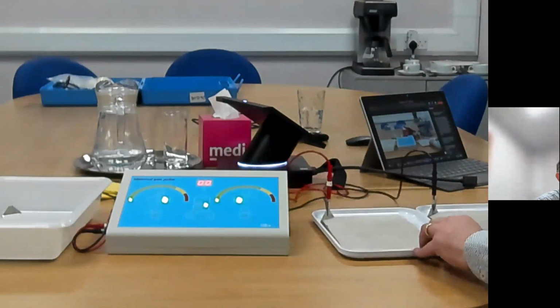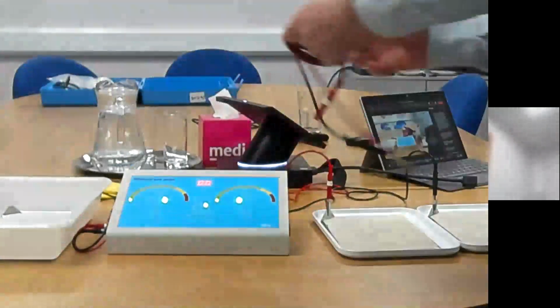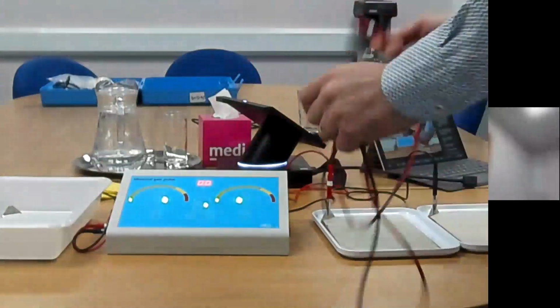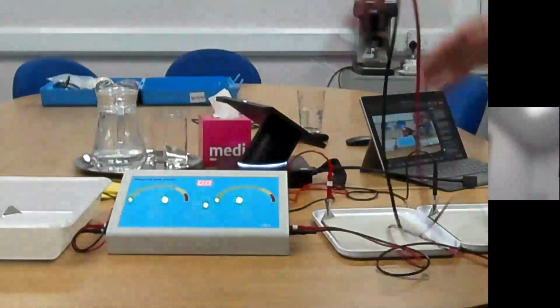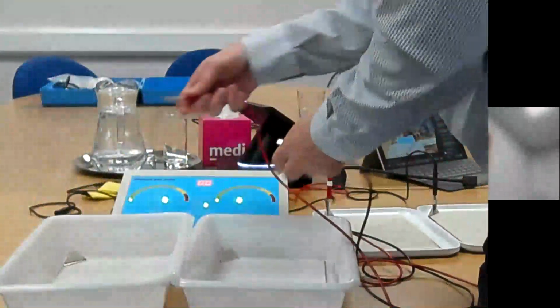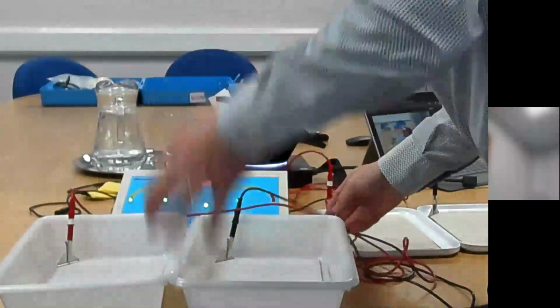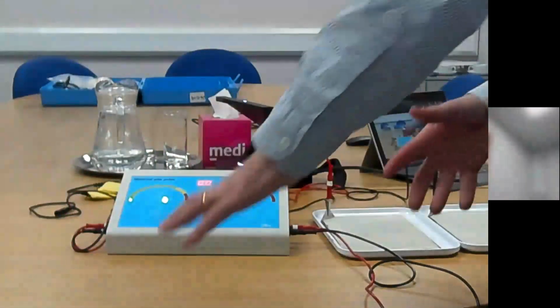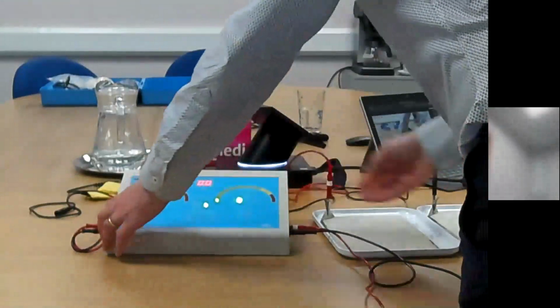Now, if you're going to treat the hands and feet together, you set the device up as follows. You take the other set of cables and you plug them into the other side of the device there. Red in red, black in black. Connect them up to the deeper foot trays, again putting the red on the same side and the black on the same side. And you'd obviously then put them onto the floor. The patient would put their feet into those and their hands into the trays that are on the table.